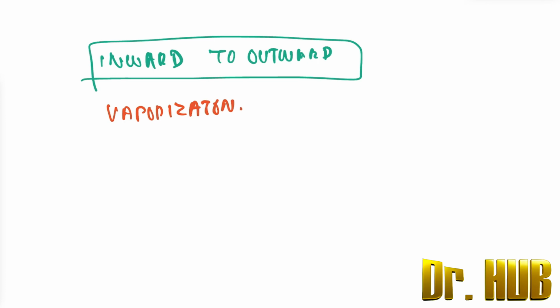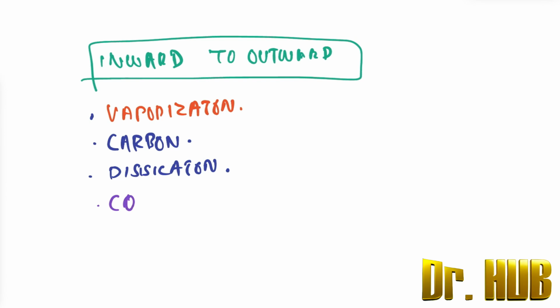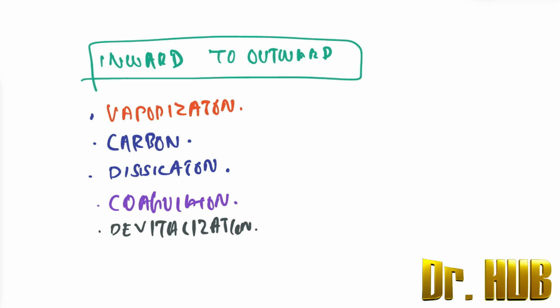Next is carbonization. Then there is desiccation, coagulation, devitalization, as well as hyperthermia.